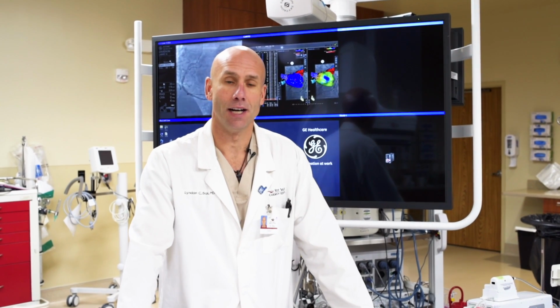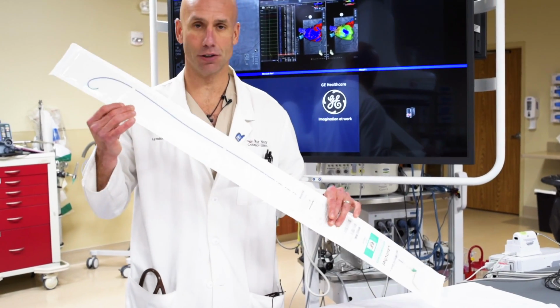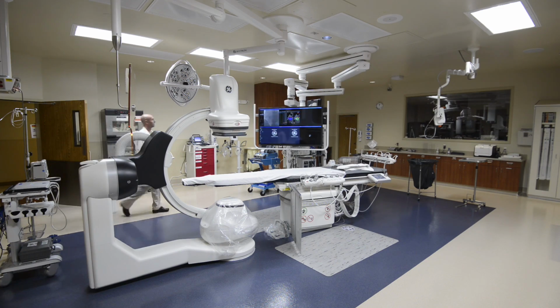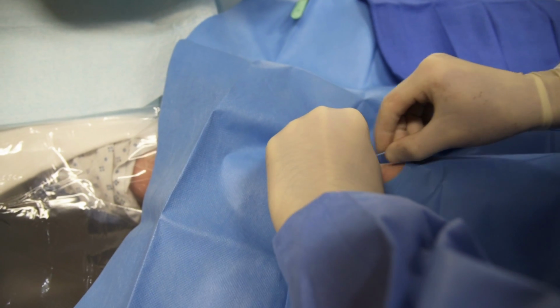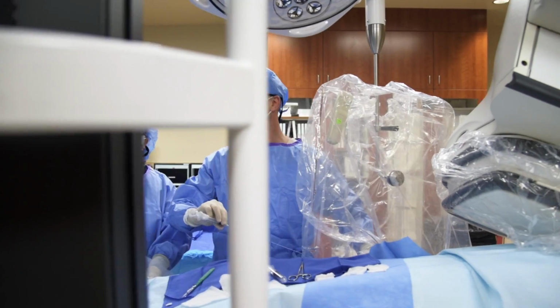We do a number of different procedures here, but one of the ones we do most frequently is a coronary angiogram or heart catheterization. That's a procedure where we take a small catheter. Here's an example. It's generally just a few millimeters across, and we insert that into the artery. Most often we actually go through the artery in a person's wrist and take the catheter up to the heart to take pictures of the arteries of the heart.